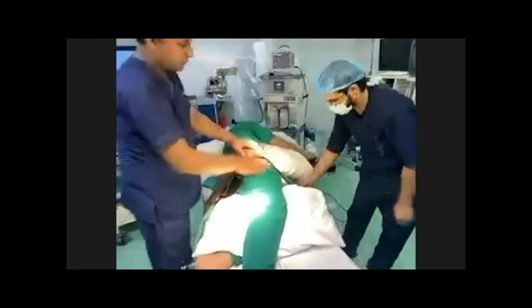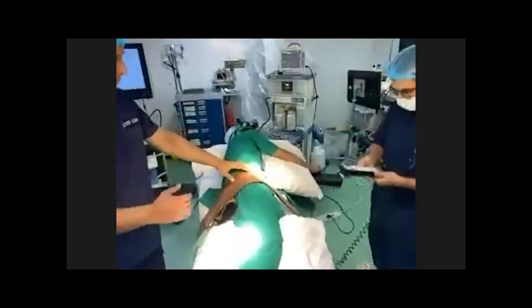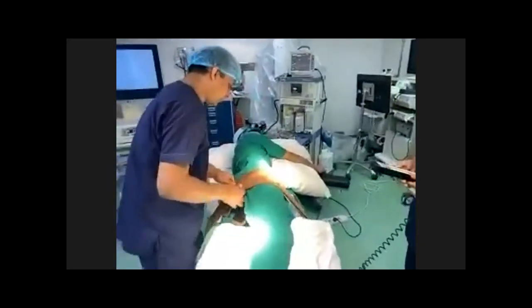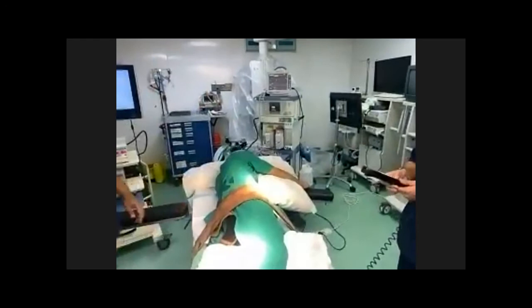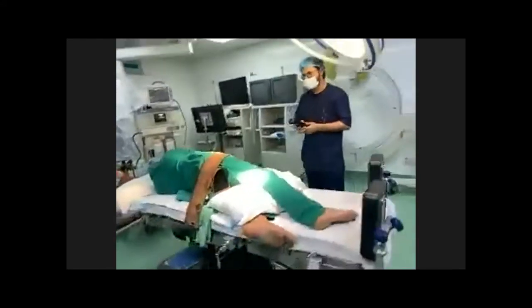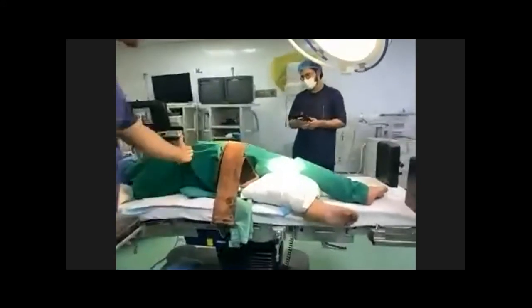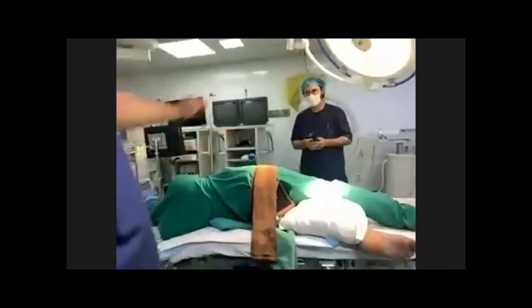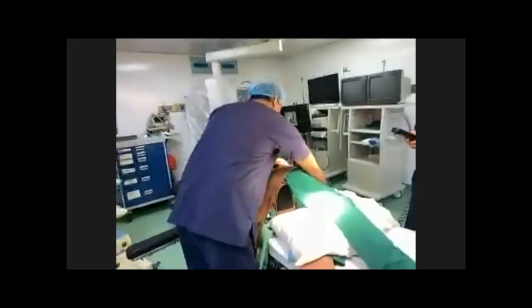Now you can break the table for some time. Break the table. In this procedure, we are breaking the table in between so that the kidneys become more prominent. That's it. Okay, you can just straighten up the patient. Okay, thank you. Just turn around.